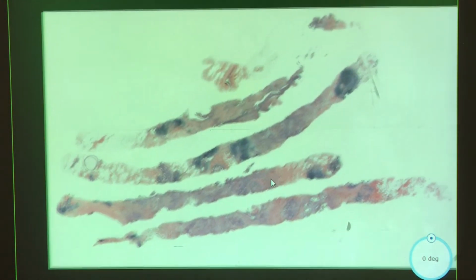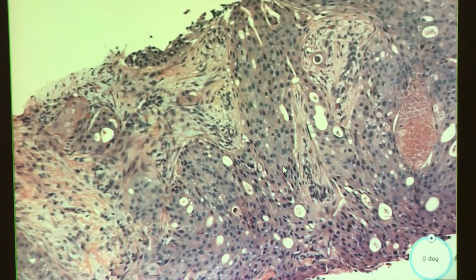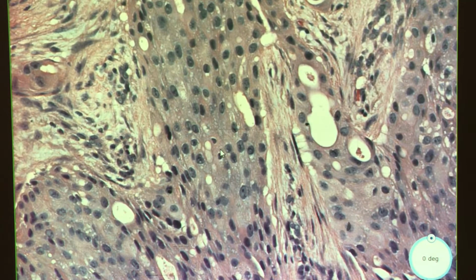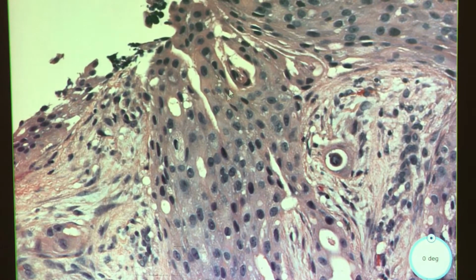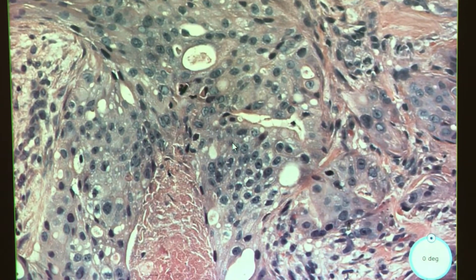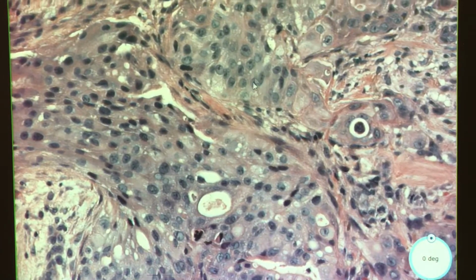What do I remember? So, okay, low power, very pink, lesional stuff in here, possibly this stuff too. Let's see what it looks like. Okay. So, the cells are relatively epithelioid. There's fairly prominent cell borders. Maybe it's trying to form glands. Hard to say. It would not be wrong to look at this and first thought be, is this metastatic squamous cell carcinoma?